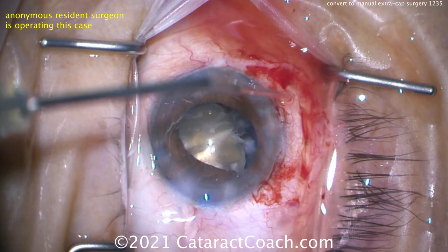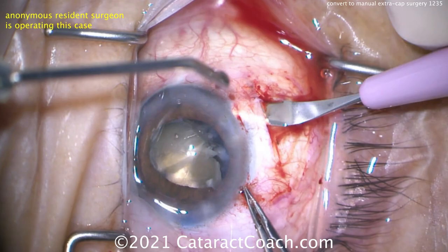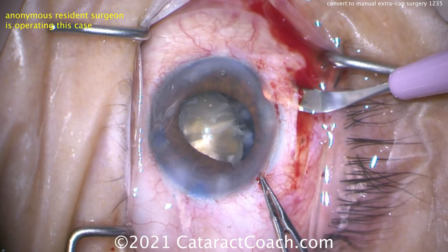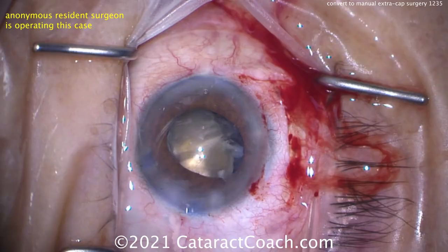Abandon the main incision. You cannot enlarge a corneal incision to this width for extracapsular extraction. So abandon the main incision and make a scleral tunnel using the SICS technique, making it sufficiently wide. Now we can enter the AC with a sufficiently wide incision to extract that nucleus, and that incision will seal very well.